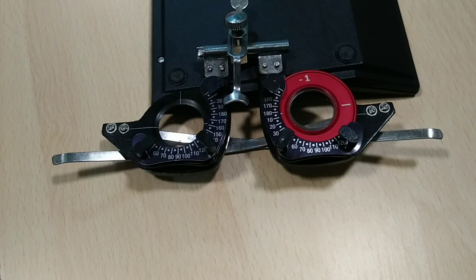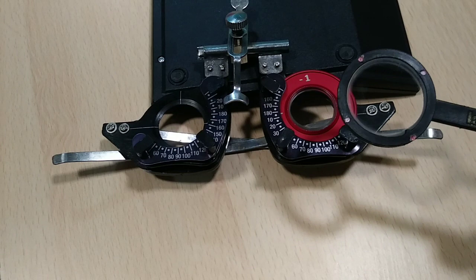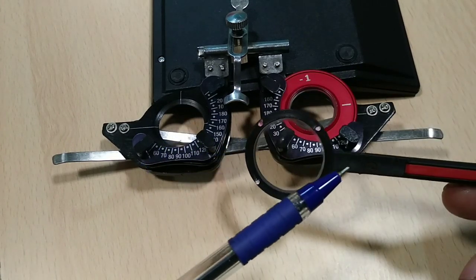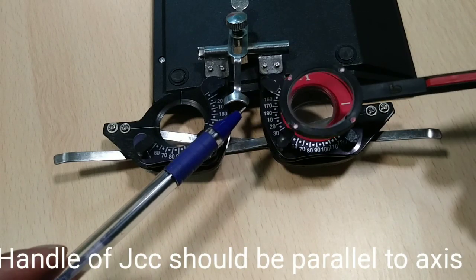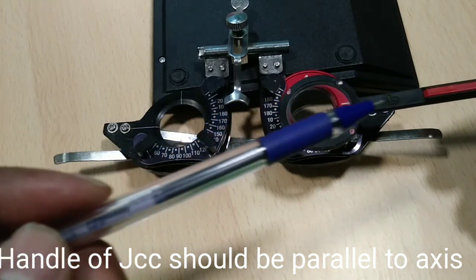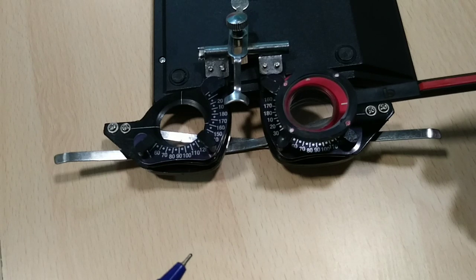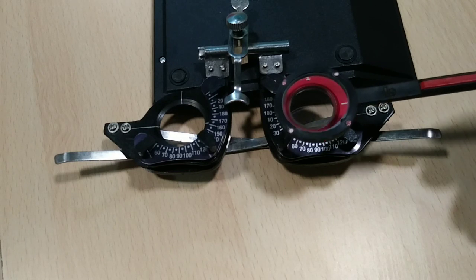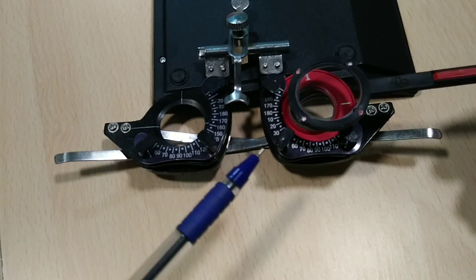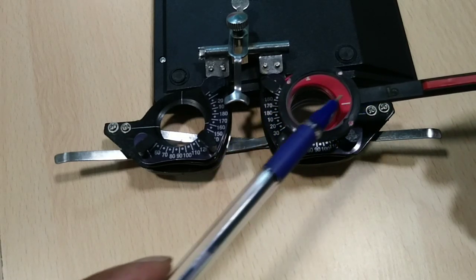Now let us refine the axis of the cylinder power. To do this, we align the handle of the JCC parallel to the axis of the cylinder power — exactly like this. You can see the handle is parallel to the axis. We are keeping the handle parallel to the axis, not keeping the lens line to the axis.